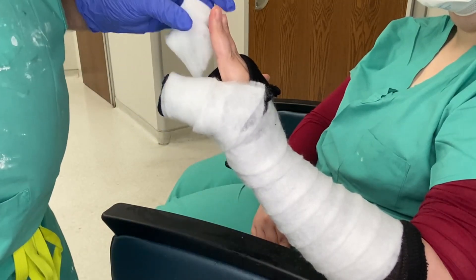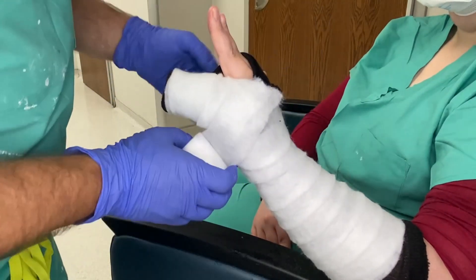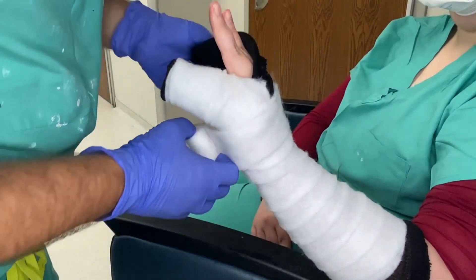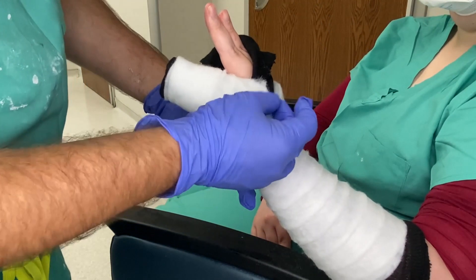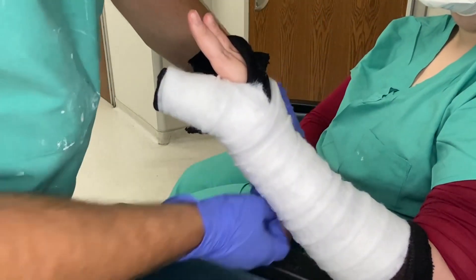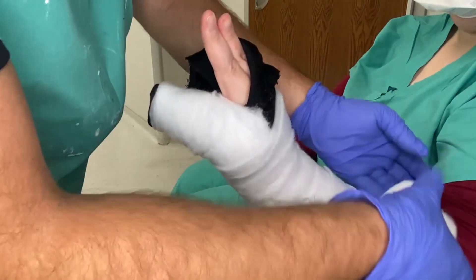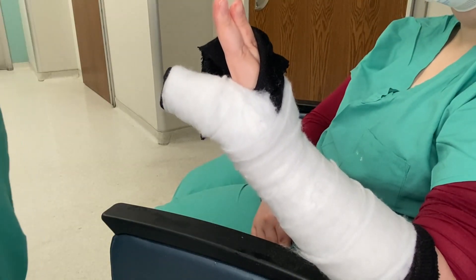Go right to the edge leaving just a little eighth of an inch of cotton showing, then go right over the edge and around the MP joints again, capturing everything on the ulnar side. Tuck all the cuts in, making it nice, pretty, and even. All you need is three layers of cotton — a lot of people over-roll because they're afraid of causing skin issues, but that's all you need. If the ulnar gutter needs a little extra, just get another two-inch roll, put what you need, and cut the rest.